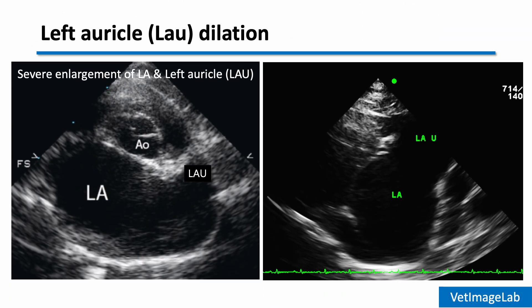It's important to assess not only the left atrium, but also the left auricle, because as left atrial enlargement progresses, the auricle often becomes enlarged as well. You can see here a markedly enlarged left auricle alongside the dilated left atrium.